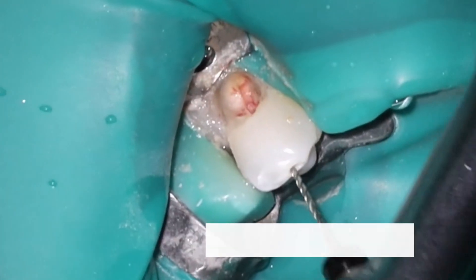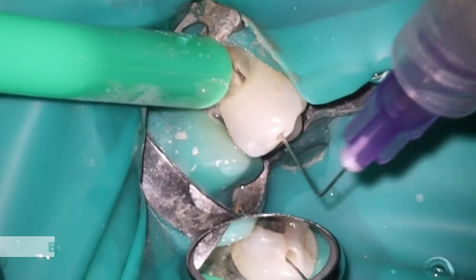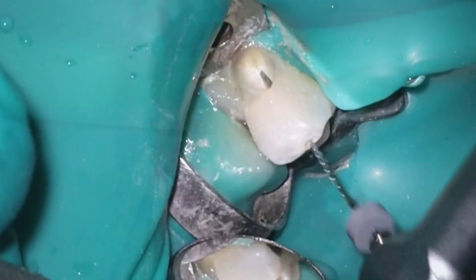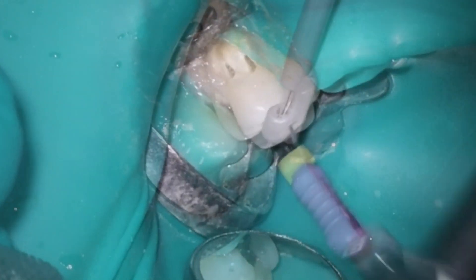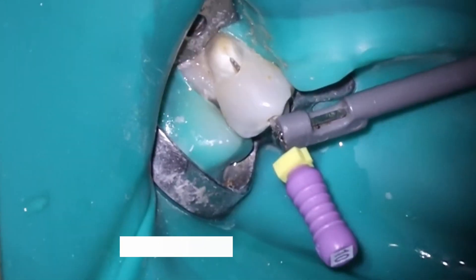As far as the root canal, it's pretty straightforward here. I do like having this straight line access for these cases. Sometimes I'll do it from the buccal if I'm able to get in there, but in this case I'm going to be placing a post inside here.